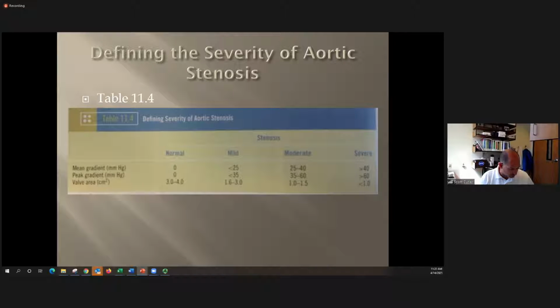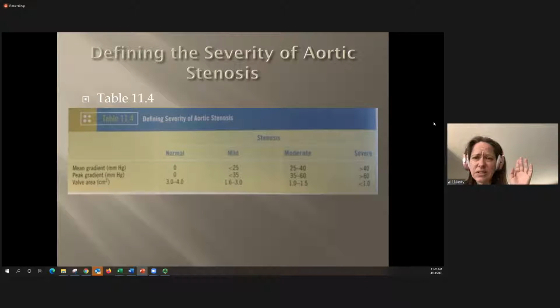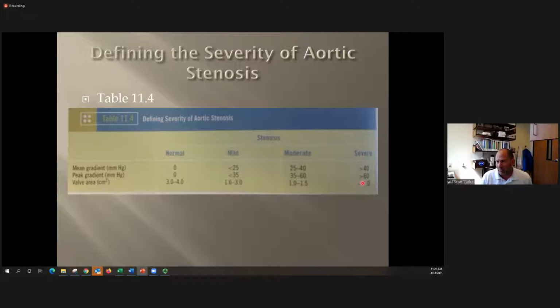So I would go off the charts in the chapter for that, and they should be consistent with the ASE standards as well. You notice when it hits severe, it's at 1. They try to keep these numbers fairly easy to remember, not decimals and stuff like that, because they could set the threshold differently. They chose to set it there so it's easy to remember. Nancy?